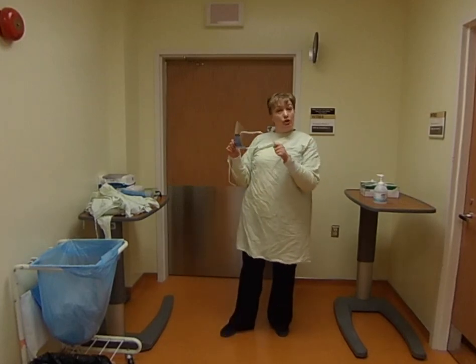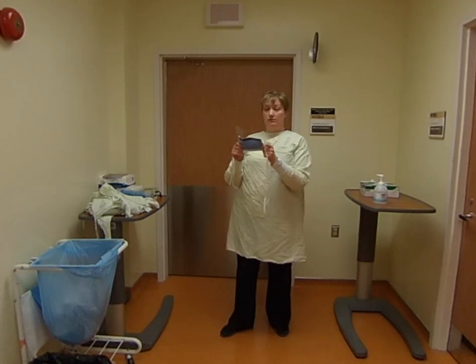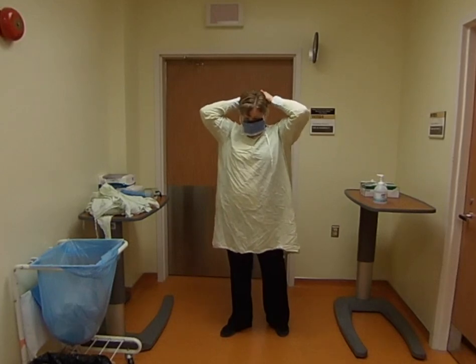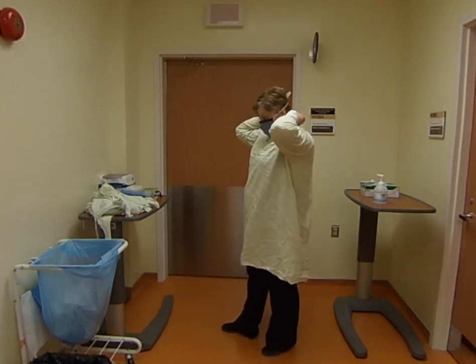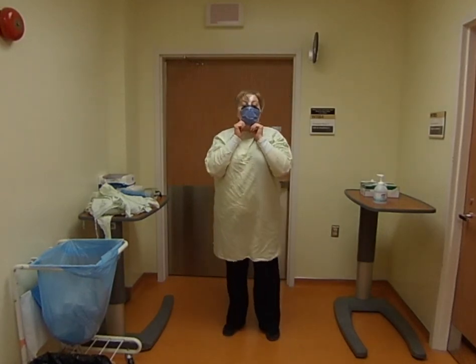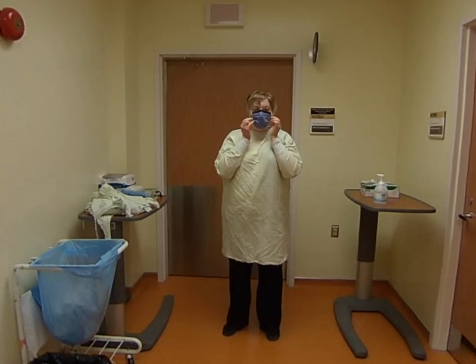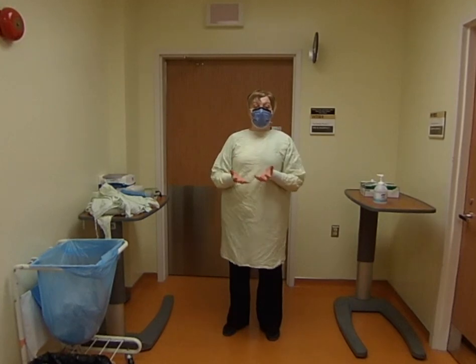I'm going to take my mask with the face visor built in. There could be different types — one with an elastic loop or one with a tie. What's really important is that it covers your face, nose, mouth, and eyes. I'm going to bring it to my face and tie the top one at the back of my head first using a bow, then take the one under my chin and tie it at the back of my neck — not at the top, because it could slide down. Pull it underneath your chin for a good cover, then take two fingers from each hand and seal it around your nose, starting at the bridge and going all the way across. Now my clothing is protected, my mouth is protected, and so are my eyes.